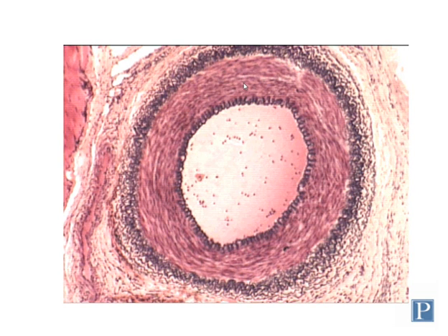several parts to it. Mostly it consists of multiple layers of smooth muscle, between 10 to 40 layers of smooth muscle, which you're seeing here. There can also be some elastic fibers throughout the tunica media, but most of those elastic fibers are again concentrated in another lamellar structure, this time called the external elastic lamina, which is similar in appearance to the internal elastic lamina but much thicker. And so the internal elastic lamina is actually part of the tunica intima of arteries, but again is not typically present in veins.